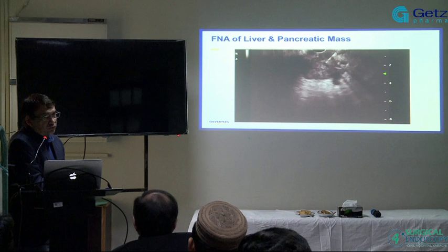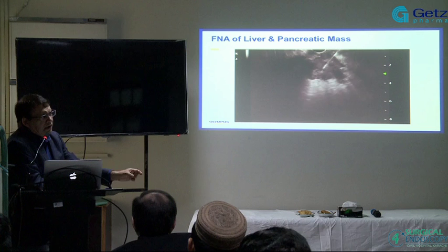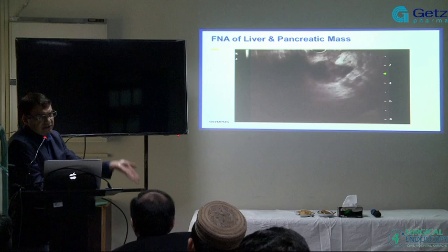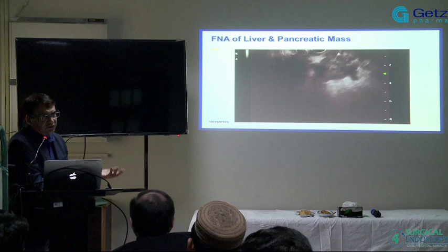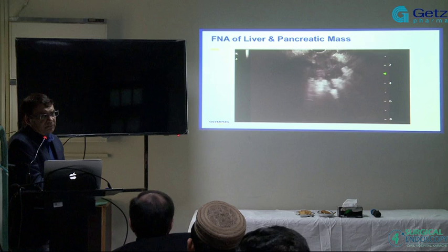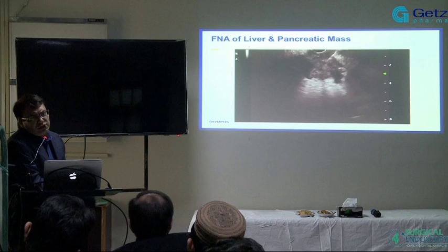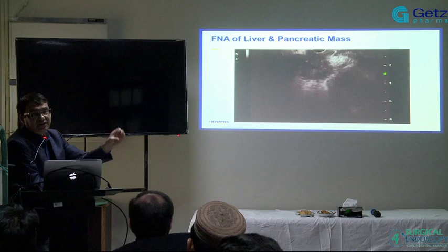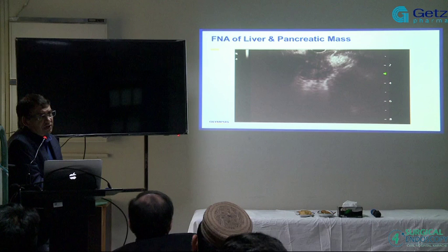Because what you do with the FNB is, you're kind of boring it. And once you go in, that tissue is out. The second time you go in, it's just blood in there. So there's no purpose of going. If you want to go in the same place twice, don't go more than twice. The second time is okay, but after that, you're going to see a white hyperechogenic line in there, which is only blood. Okay, so for FNB, you really don't have to go 16 times.